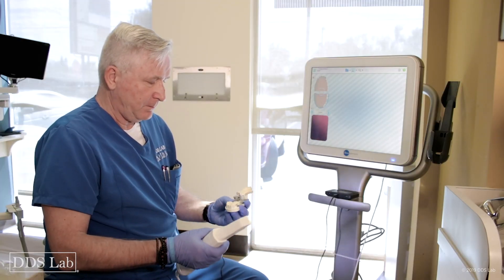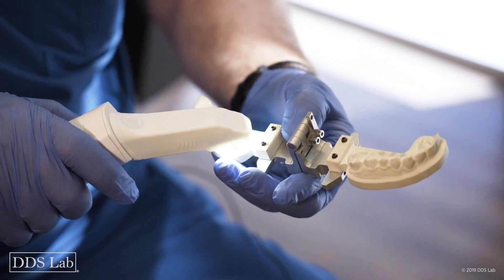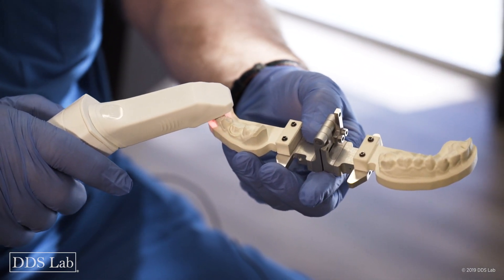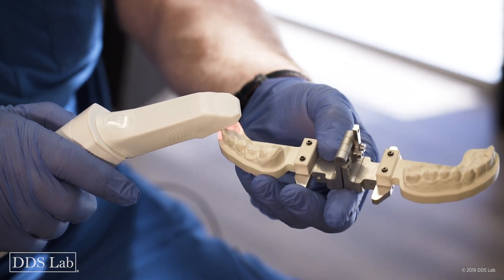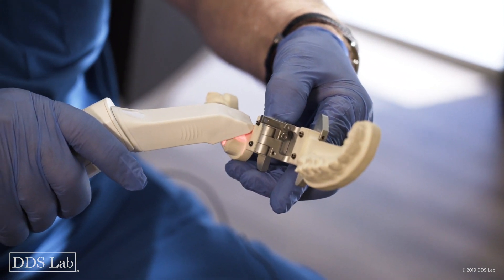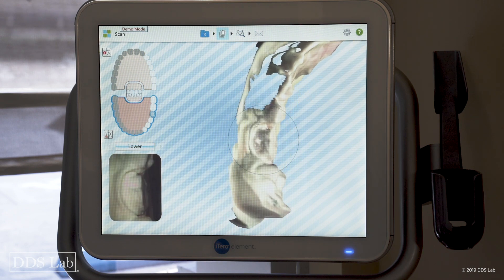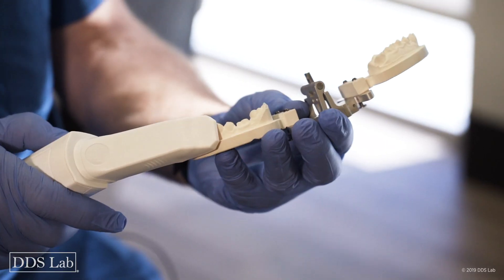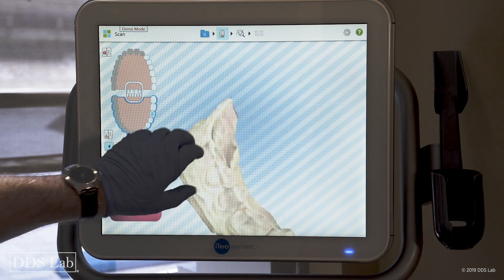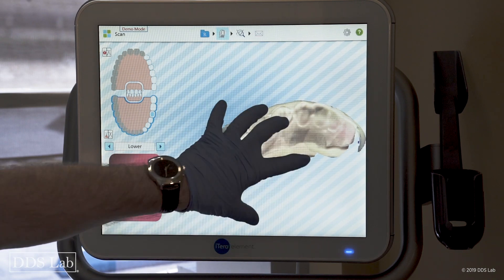Checking my scan — it's absolutely perfect. I have contacts on both sides and my margin looks wonderful. Next is the prep quadrant scan: I start at the terminal molar on the occlusal, come forward, get my camera a little bit down, come back on the lingual part, roll over to the buccal on the terminal molar, and the scan is done. Looking at it — absolutely perfect, nothing is missing.